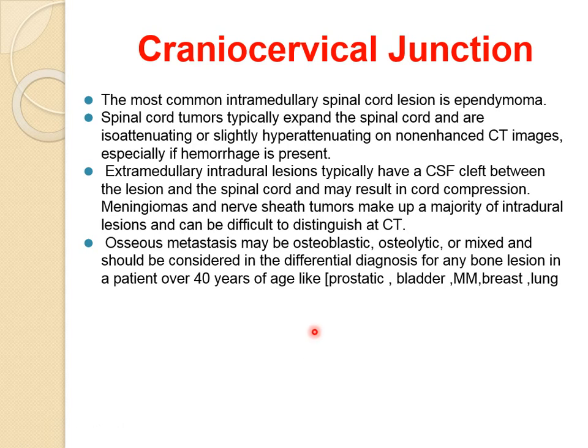The cranial cervical junction is also involved in neoplastic processes such as ependymoma, which is the most common one, which expands into the spinal cord and shows slightly iso or hyper attenuation on non-enhanced CT images. Extramedullary intradural lesions have a CSF cleft. So if it is intramedullary, most likely it's an ependymoma. On non-enhanced CT images, it's iso to hyper.